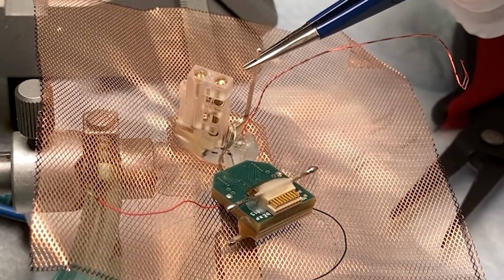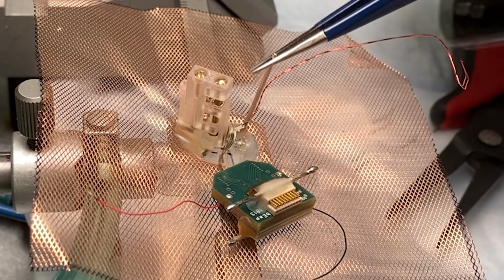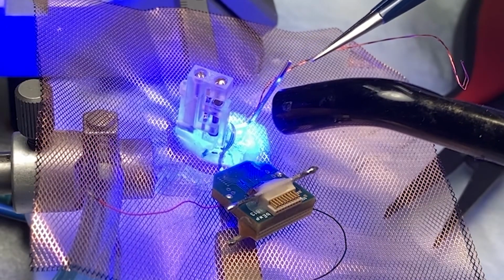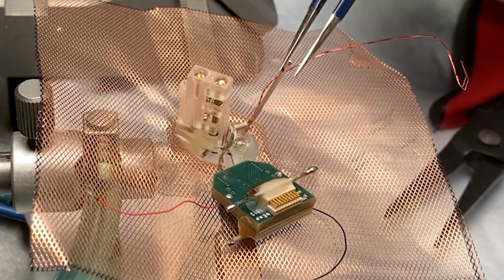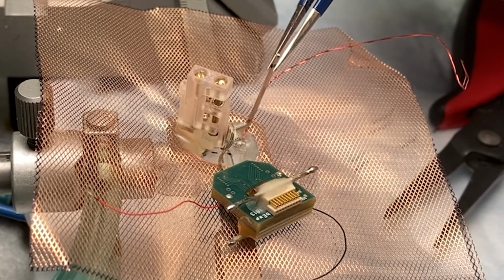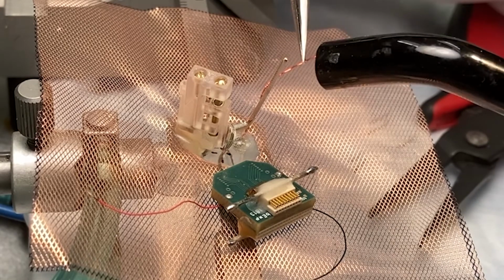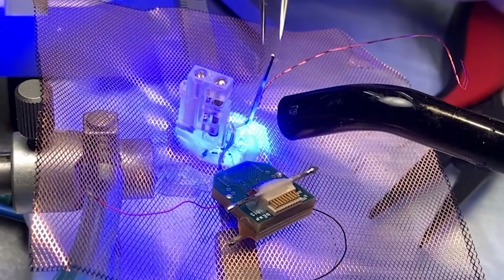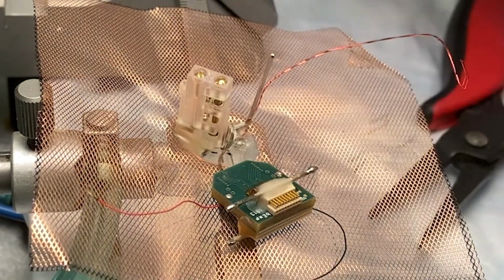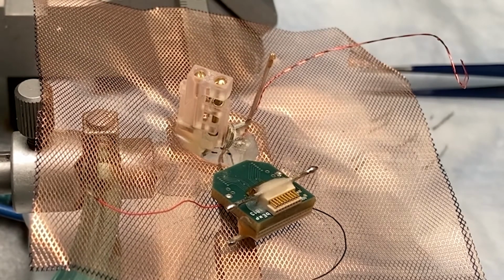To build that, we first glue some metal bars with dental cement. Depending on your probe location, you can adjust the height and the shape of these metal bars, and you can create basically any form. Later on, these metal bars will support the Faraday cage around the silicon probe. So once we have one metal bar secured, then we can move the Omnetics connector and attach the whole PCB to this metal bar.